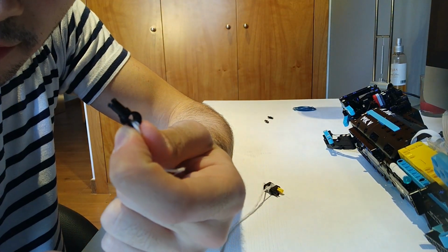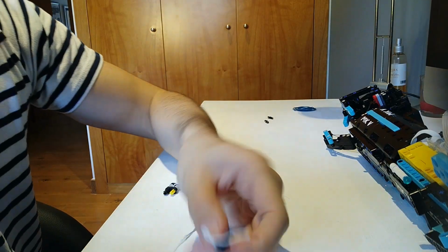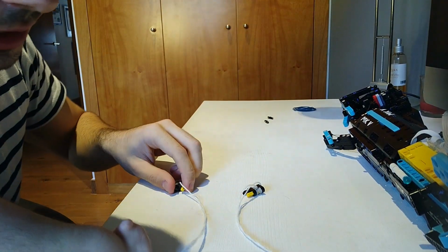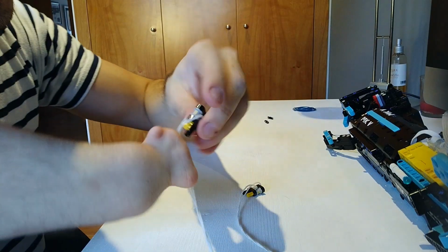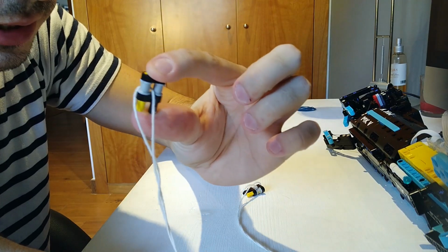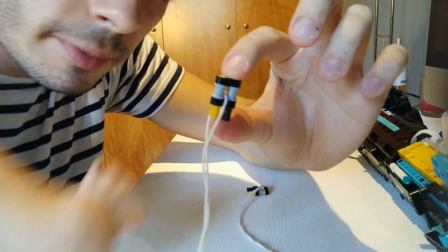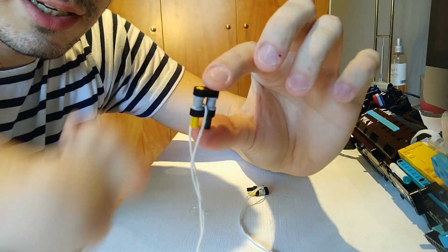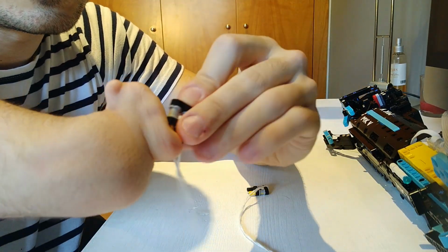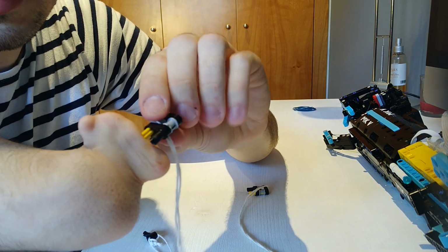There's this brick on the front right here that you need to take apart. Well, actually both sides. And you need to connect a cable to each one of the pins with holes. And you are going to build the exact same thing for the motors on the top part as the motor that's inside here. 2 Technic bushes, 2 Technic 1x2 lift arms, 1 Technic 1x3 axle, and 1 pin that has an axle of 2 inside right here.